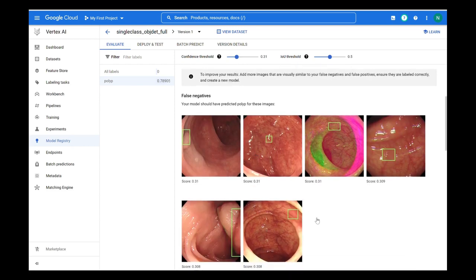The CAD-E model trained using Google AutoML had an average precision of 0.789. The precision at an intersection over union threshold of 0.3 is 0.977 compared to 0.997 for a purpose-built model based on the SUN dataset. In general, the higher the IOU threshold, the lower the precision because the predicted and actual bounding boxes need to overlap more for an image to be considered a true positive. The average precision in this context is the average of all the precisions when the model is evaluated across all intersection over union thresholds.